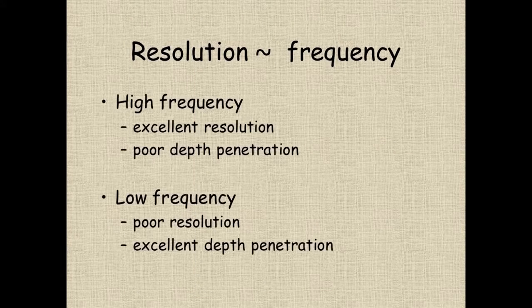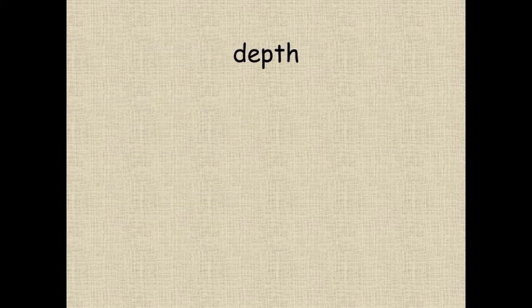Resolution is heavily related to frequency. The quality of the picture is related to the frequency of the ultrasound beam, with the general principle being that high frequency probes give excellent resolution but only a very poor depth penetration because of all the signal attenuation, and low frequency settings produce poor resolution but an excellent depth penetration because there's less tissue loss of the ultrasound energy as it goes through the deeper tissues.